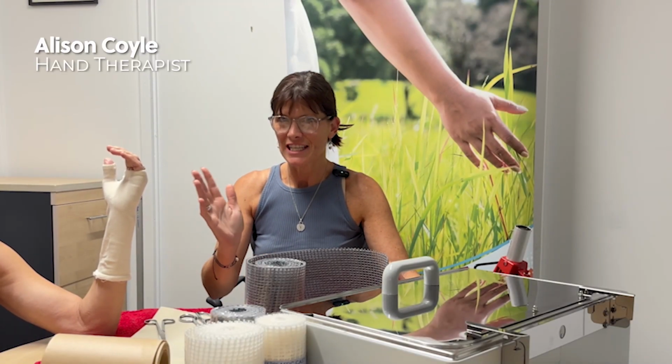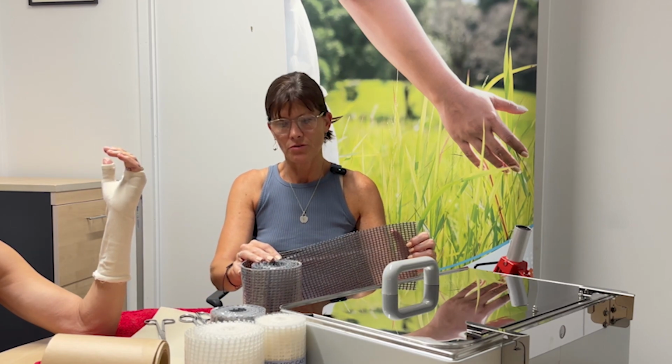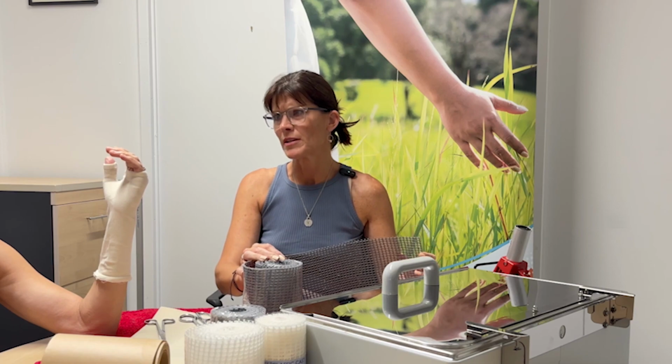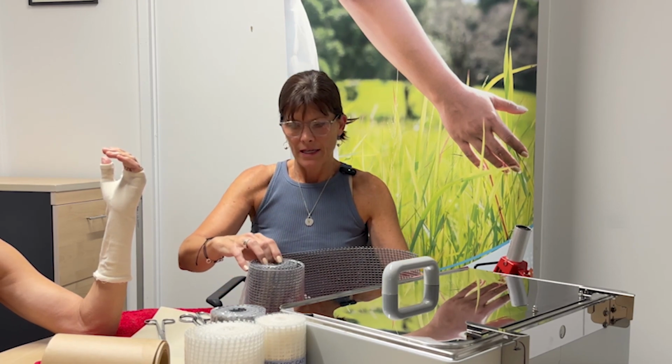So I don't need to teach you guys how to make splints. I'm just going to show you how to do different splints with these products and what makes them unique. So I'm going to make a dorsal blocking splint, like one that you'd make for a flexor tendon repair.